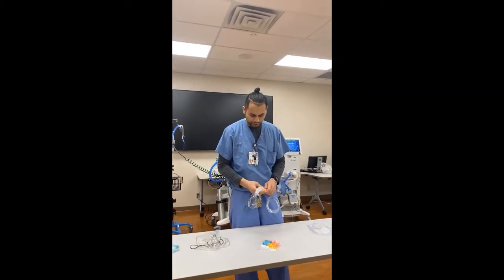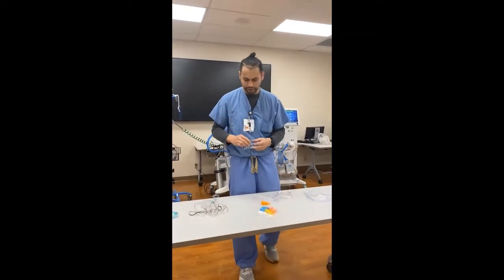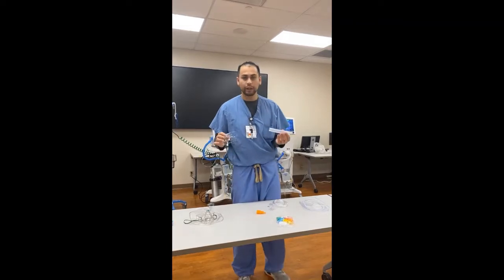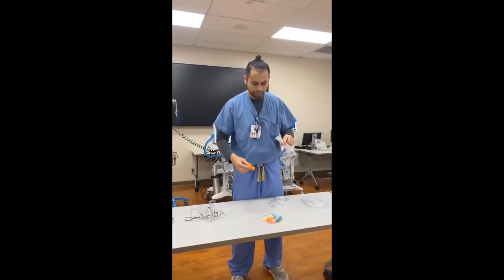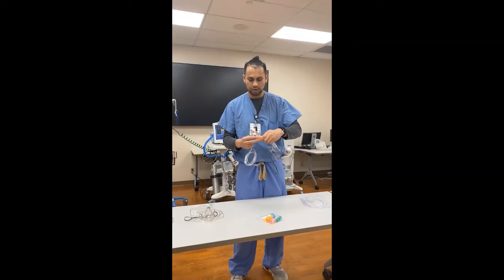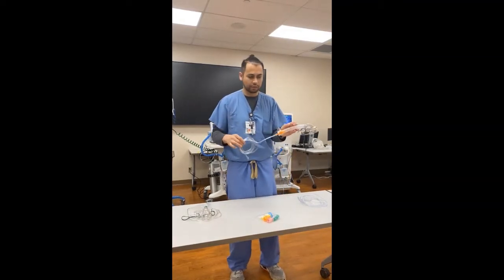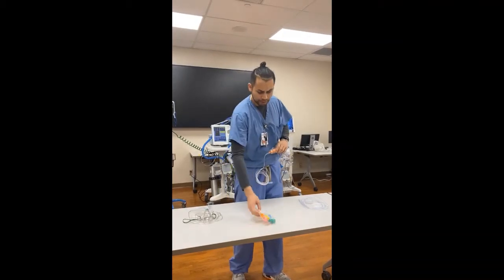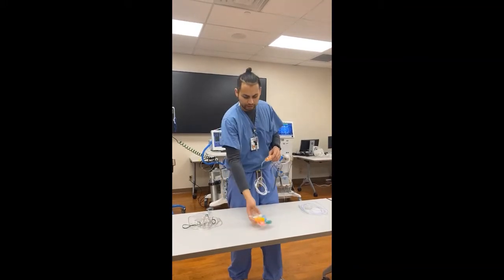It's very easy to set up. It will come assorted in the little packet. It comes with the mask. You have your corrugated tubing, which connects to the mask here. Then you have your desired FiO2 chamber, connected at the distal end of the corrugated tubing, plastic to help with the entrainment, and then the nasal cannula extension for it. This is the 50% entrainment here, which will be at 15 liters, but you have as low as 28%, and the lowest flow rate on that will be about anywhere from 5 liters to 8 liters.